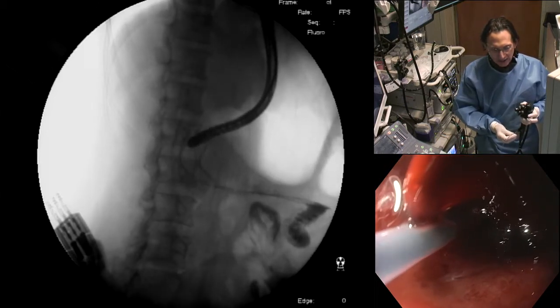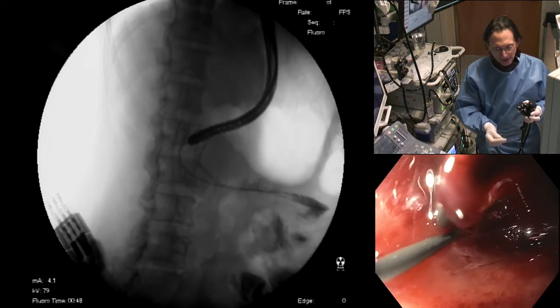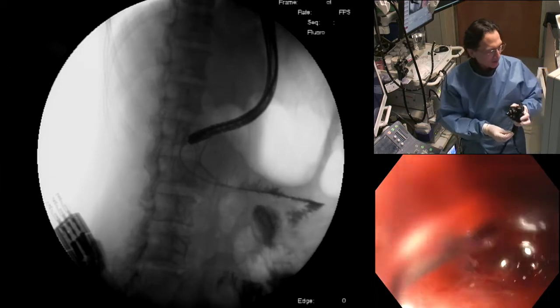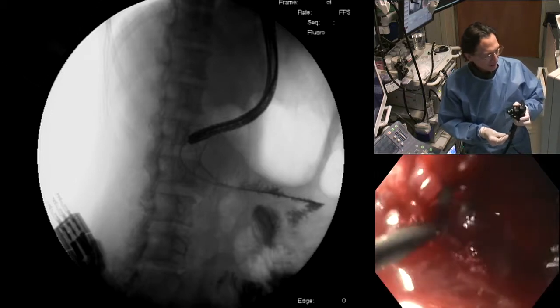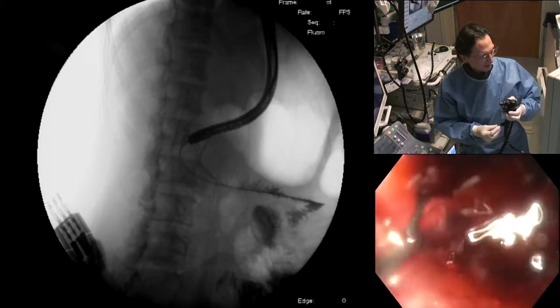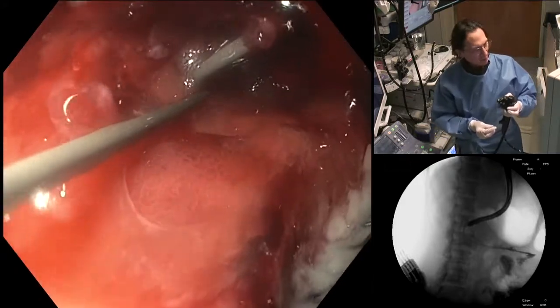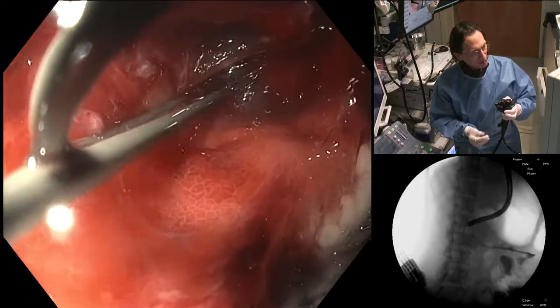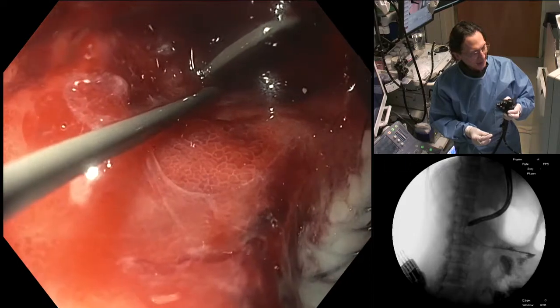No, I think you can leave the pigtail because the pigtail will give it a little bit of anchorage. I sort of like that. All right. Okay, let's take a look. It's just coiled up on itself. It's not a problem. Okay, we can look on the endo view. Keep pushing, please. We don't have to step on the fluoro the entire time. Let me just pull back just a little bit. So here we're just using the endo view to guide our exchange. That wire that you see there is just coiled back because it's coiled back at the ligament of Treitz.